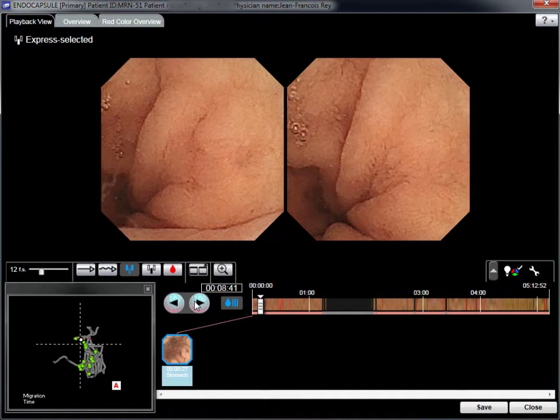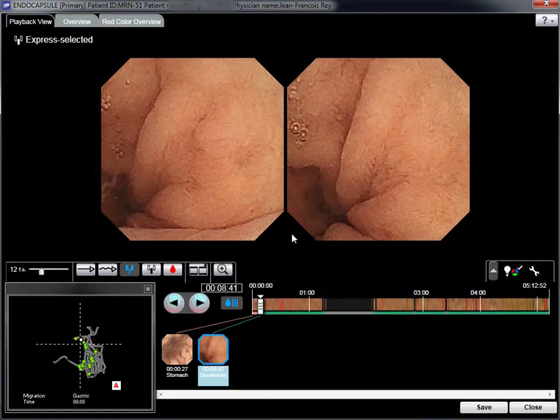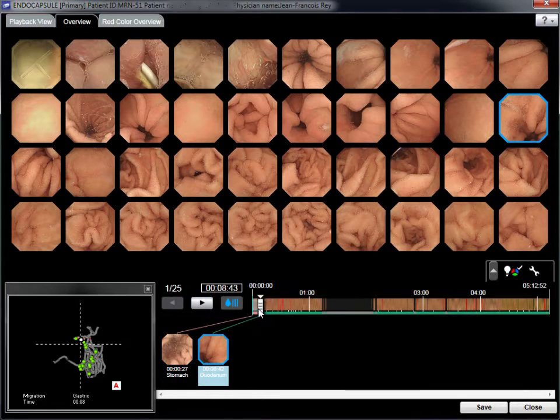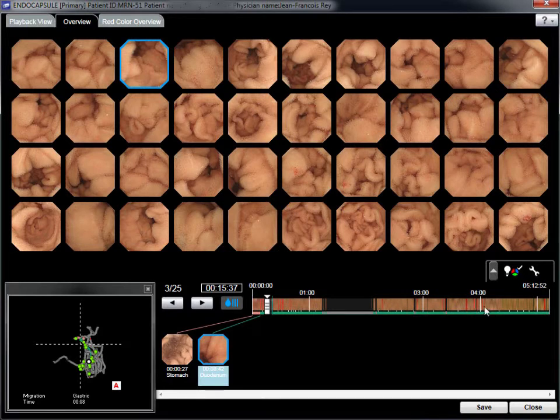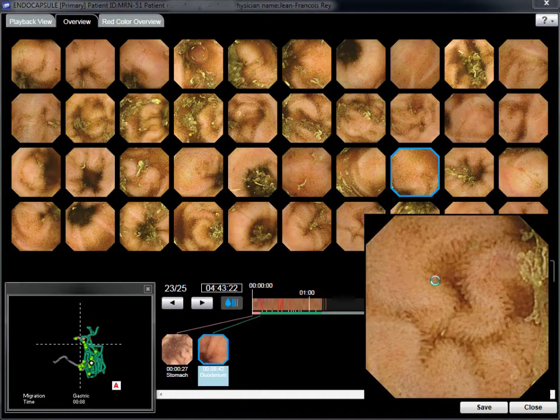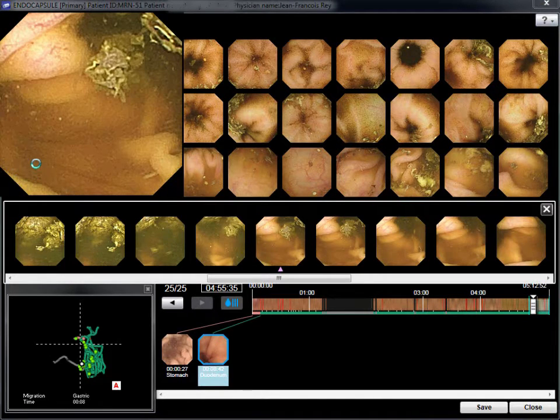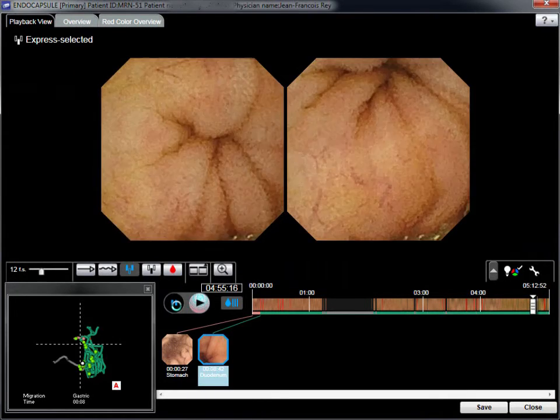Selection of a landmark activates the 3D tracking image display. Moving the capsule bar allows all of the small bowel images to be displayed as far as the first cecal image. Details of the terminal ileum aspect are enhanced. The enhanced aspect of the cecal mucosa shows marked differences from the ileal picture.